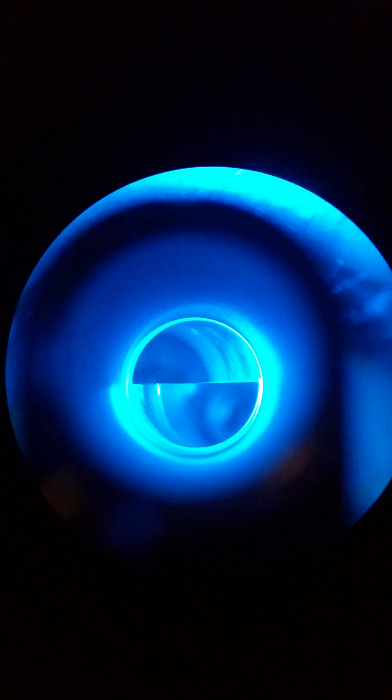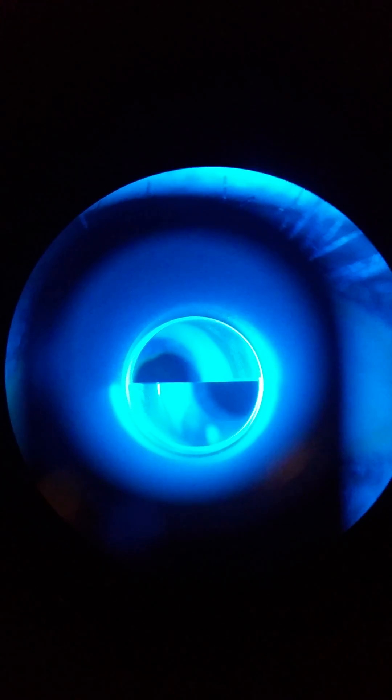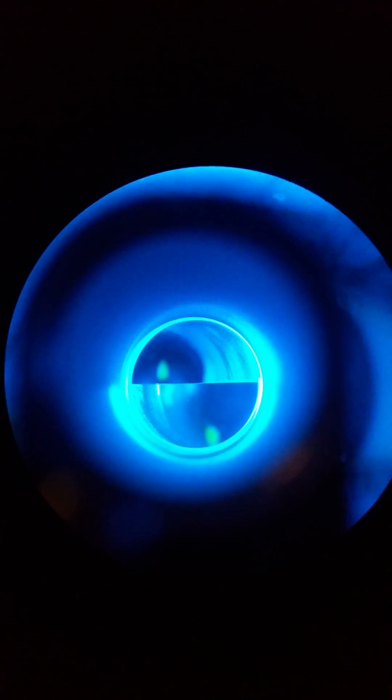If you're too high, you'll see that goofy circle down there. Come down — that's perfect. And this is too low — and off, and the other way.